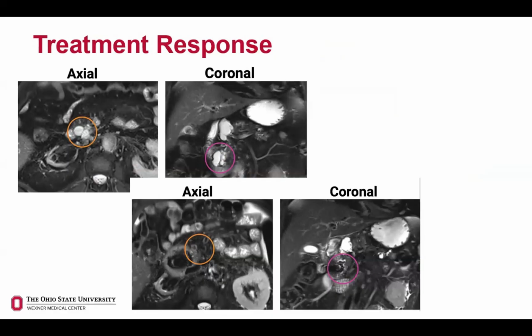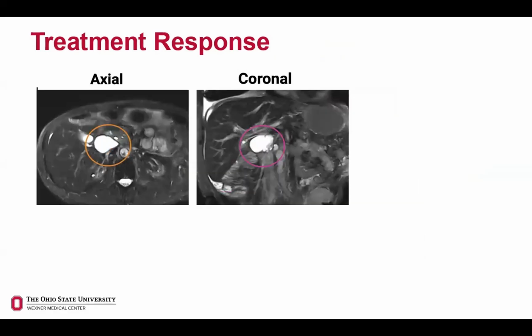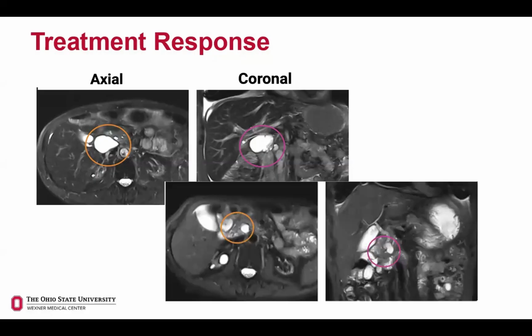But here is another cyst, and this is where you leave a fragment. Here is a cyst of 4.5 centimeters, fairly unilocular in appearance, that underwent RFA. And you see that there is a small fragment left behind right there. So you've got to count all those small fragments left behind, and sometimes you could have more than 1 or 2 fragments.